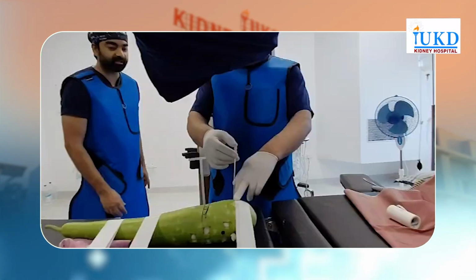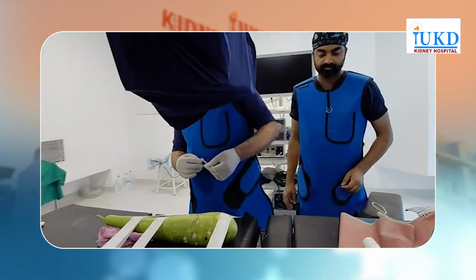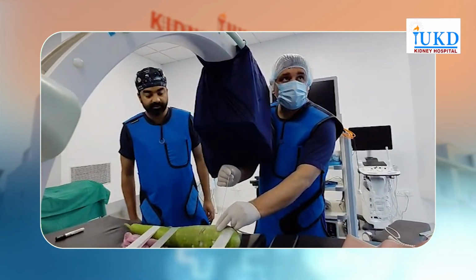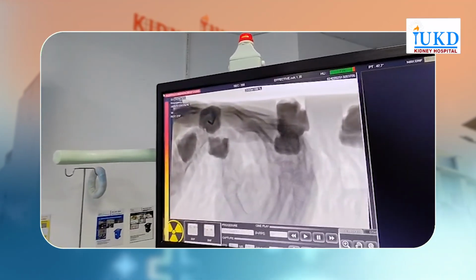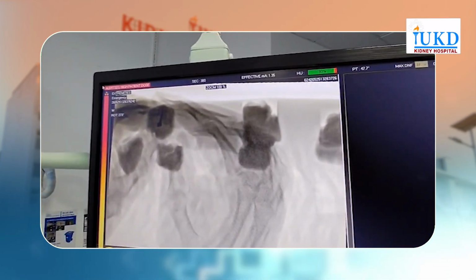Okay, this is how you do it. So it's superficial. Big problem. You try once there. Okay. Make it 30 degrees. Make the lower point fix. Go. Introduce a little with your left finger first. No curve should be seen. Only bullseye, like a bull.